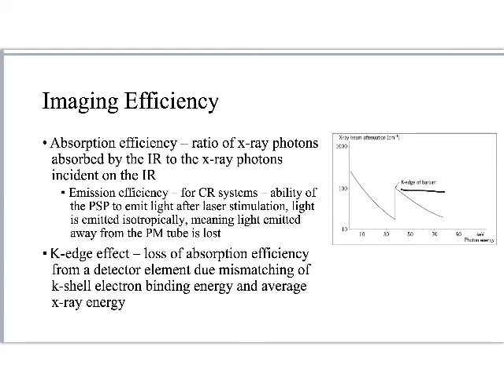Now you're probably saying, why is that important? Well, the reason it's important is because we get these little bumps. We get these little saw edge effects, right? And that's what we're talking about when we talk about the K-edge effect. Everything to the left of this little bump were photons that did not have enough energy to liberate that electron, right?